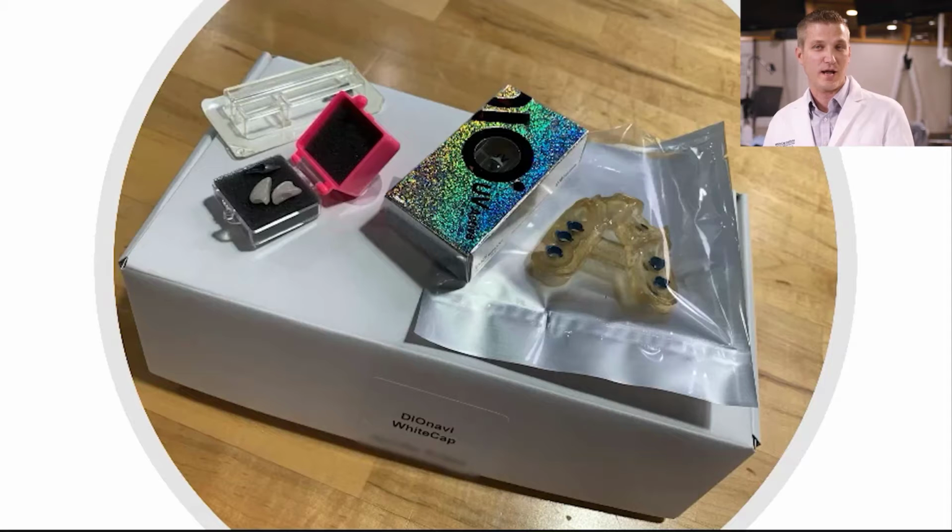You see the surgical guide, you see the dental implant, my custom abutment, 2 different temporaries, hopefully to get the shade just perfect. I ordered 2. Don't have to do that, but I'm a little bit OCD, so I thought let's order 2 and make sure we get the shade just perfect. And then you see a backup healing abutment if we decide for some reason not to put the temporary in today.